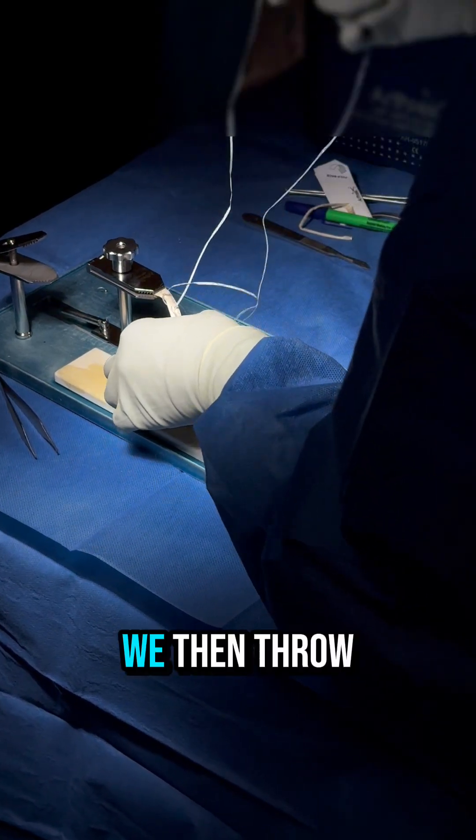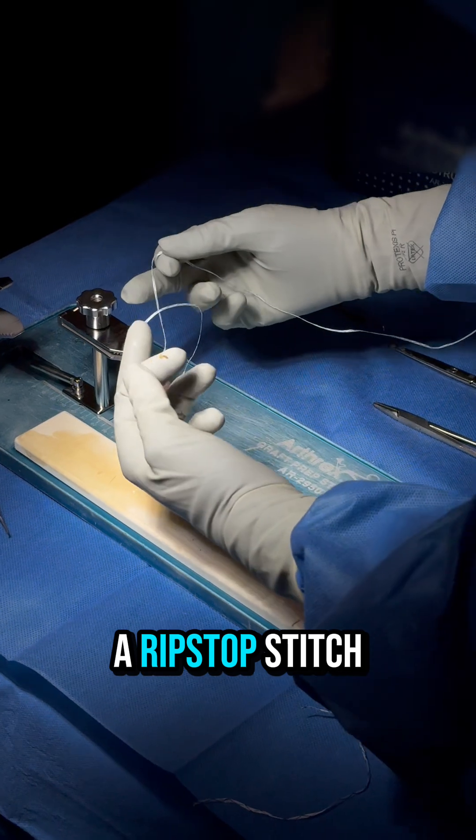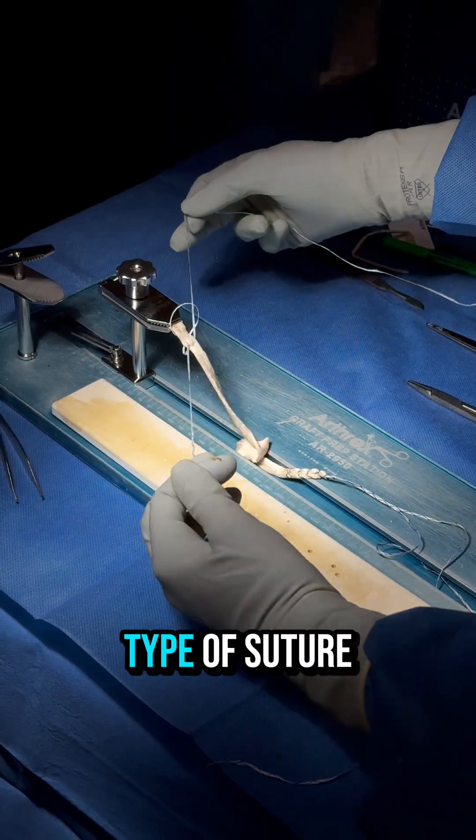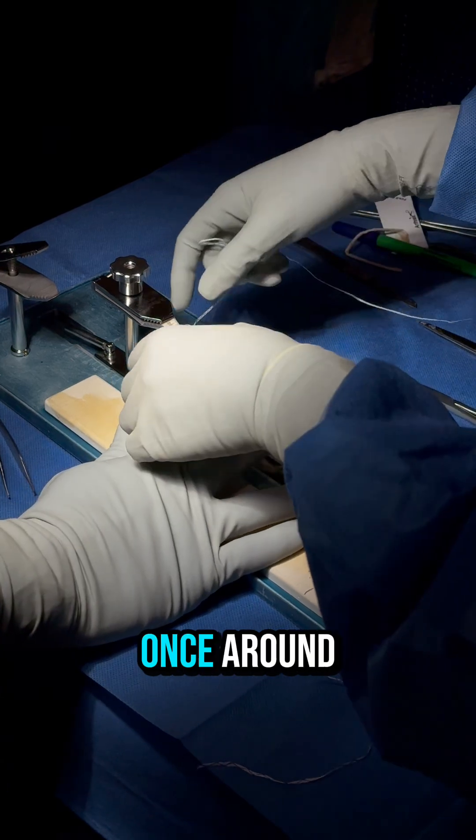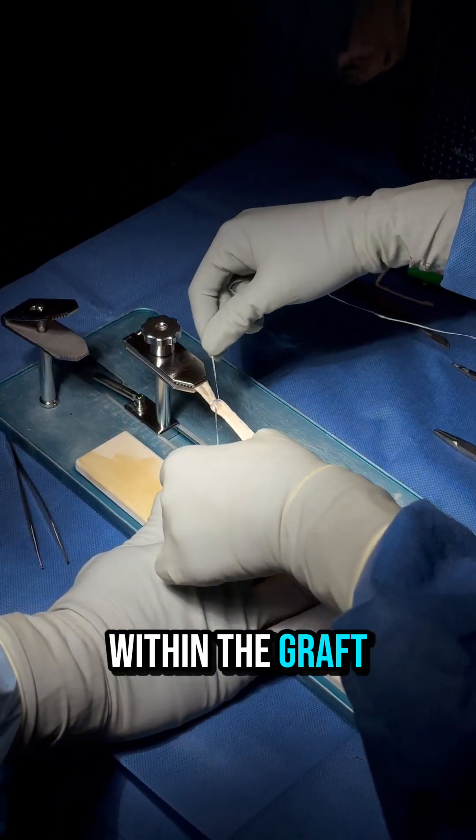On the anterior end, we then throw a ripstop stitch using a specific type of suture. This suture is once through and once around, then with an embedded knot within the graft.